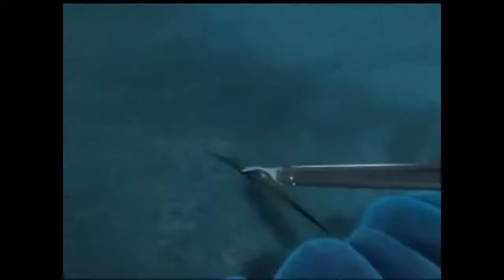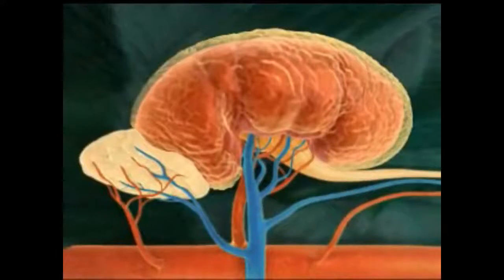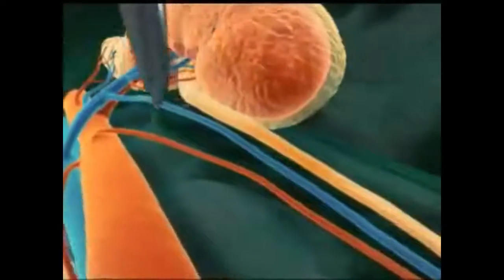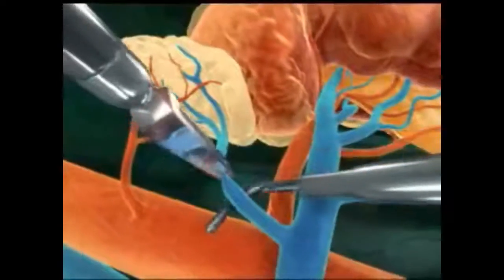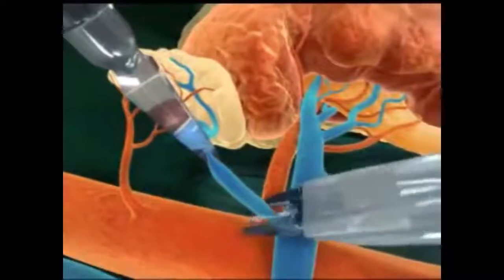Following placement of the instruments, the bowel is mobilized and the kidney is exposed. The ureter is first identified. The gonadal vein helps to identify the boundaries of the dissection. Tributary vessels, such as the adrenal and the gonadal vein, are controlled.